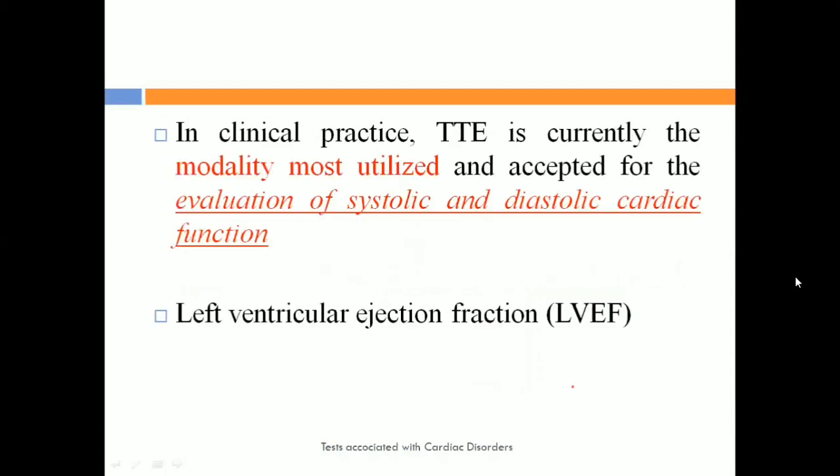And next one is, so at present in clinical expertise, transthoracic echocardiography is one of the major things which has been accepted and utilized for evaluation of systolic and diastolic cardiac functions. Is it clear? So next one is left ventricular ejection fraction.